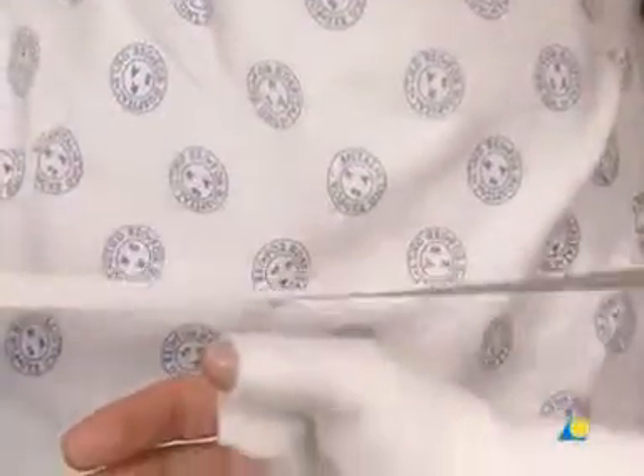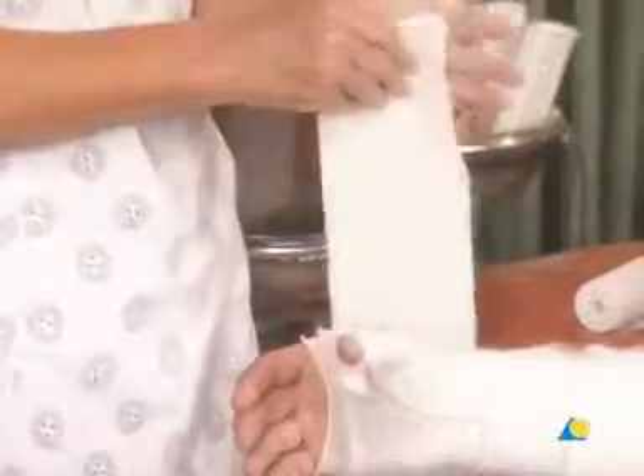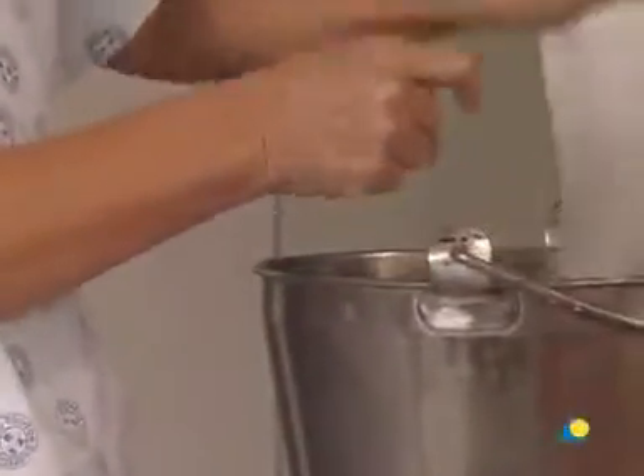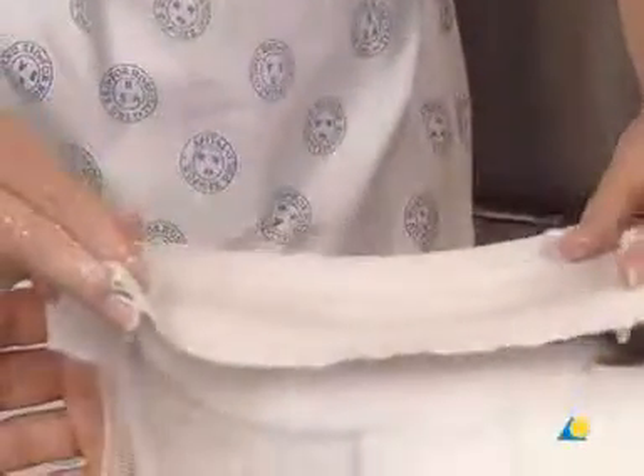A length of plaster bandage is torn off and folded over to form a slab. The slab is then wetted and placed over and around the thumb.